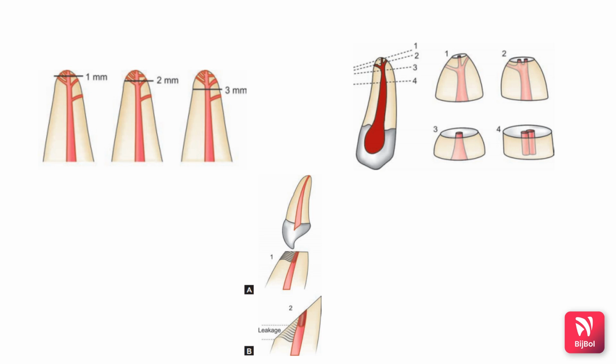But few studies have shown that the beveling of the root end results in the opening of the dentinal tubules on the resected surface area, which communicates with the root canal space, causing the apical leakage even after the retrofilling is done. So a bevel of 0 to 10 degrees is recommended for resection because it allows the inclusion of the lingual anatomy with less reduction, and if multiple canals are present, increase in the bevel causes the increase in the distance between them.